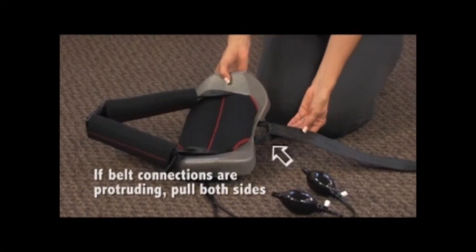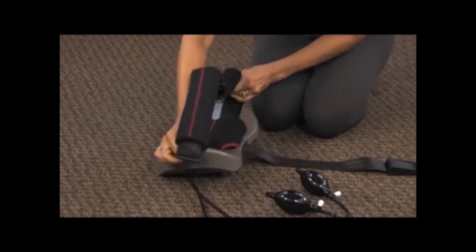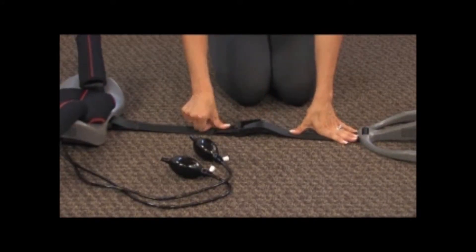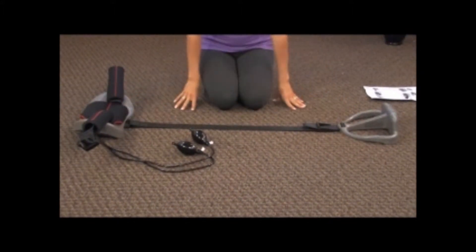If belt connections are protruding from the back unit opening, simply pull the right and left sides of the pelvic belt away from each other before making adjustments. The further apart the back and foot unit are from each other, the less the pelvic pull. The closer they are together, the tighter the pull.